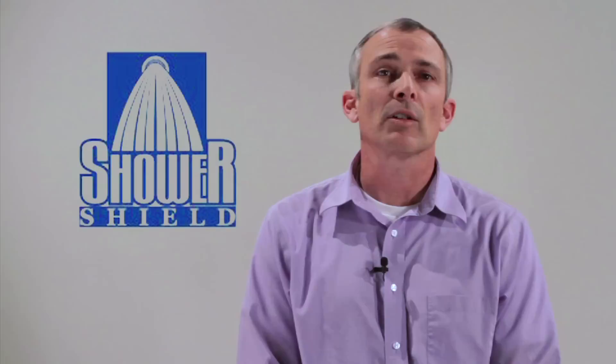To remove the Shower Shield, simply peel off in the direction of hair growth. If the patient has delicate skin, you may need an adhesive remover, but for most patients, the dressing will come off rather easily, leaving only a little redness.